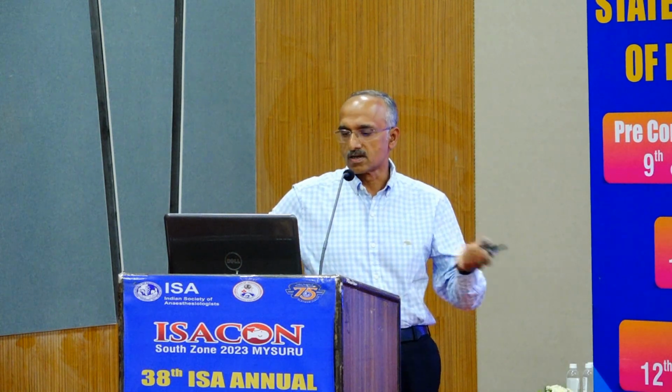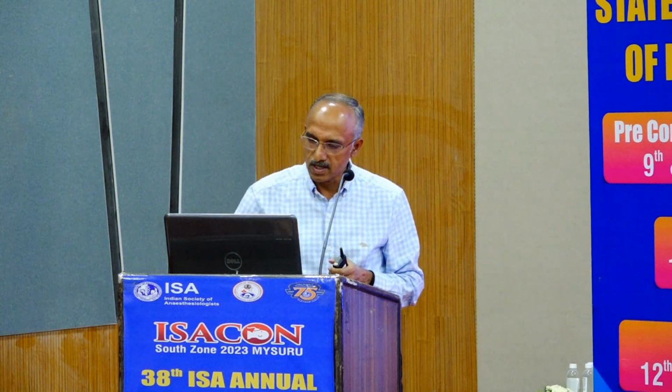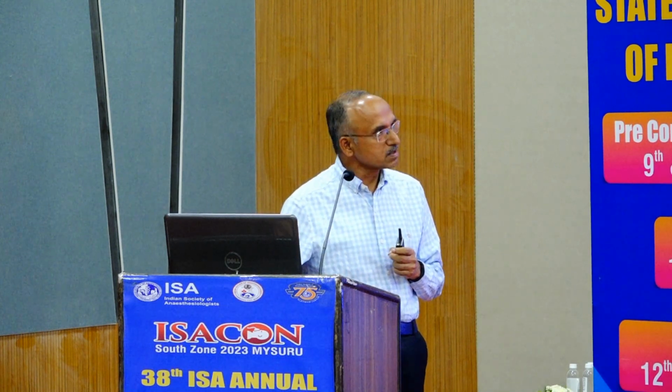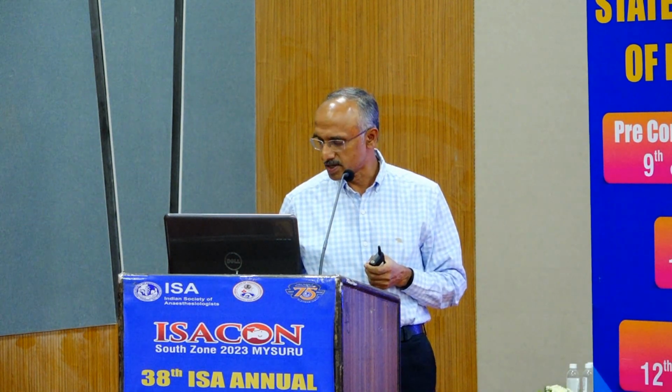So using a ventilator as a probe of physiology to monitor respiratory mechanics is what this talk is about, and it gives the assessment of mechanics and provides an insight into the pathophysiology of the lung, and it's real time, and that is to provide lung protective ventilation.